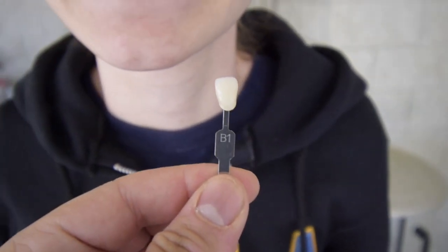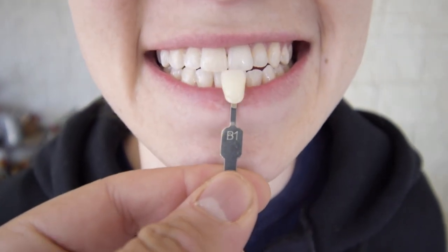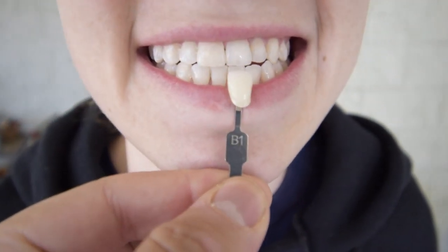After selecting the closest matching shade, you want to take that shade tab, put it in the same plane as the patient's natural teeth, snap a photo — ideally with a DSLR camera — and then communicate that shade to the dental laboratory you're working with. This is critical, especially in the anterior aesthetic zone, because if you have a shade that's a little bit off, your restoration isn't going to look as natural as possible.